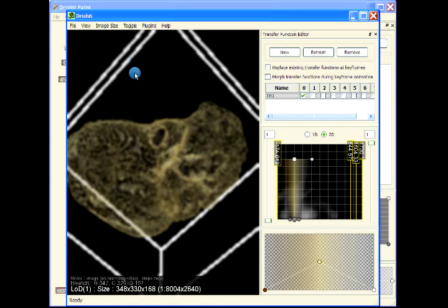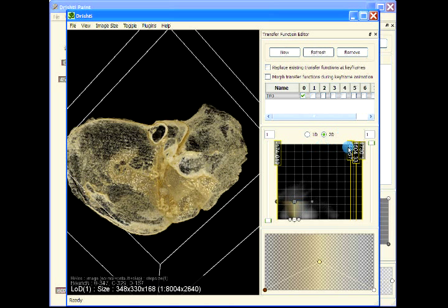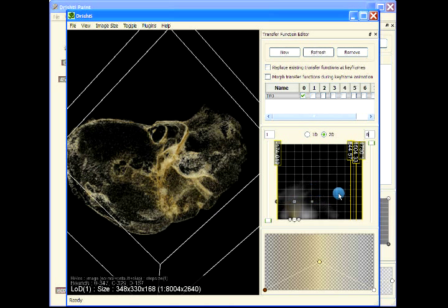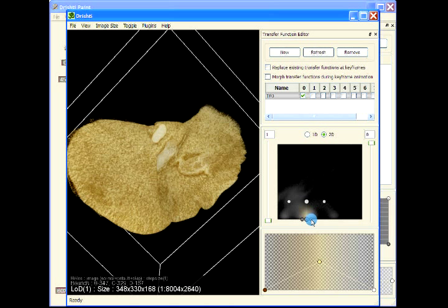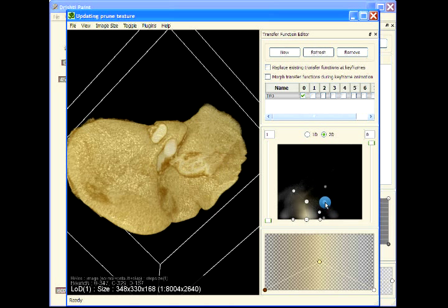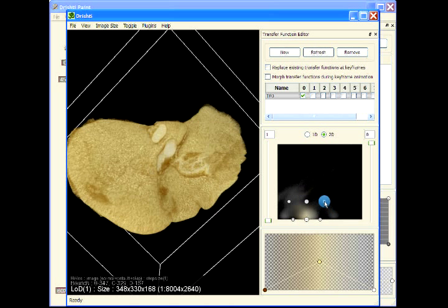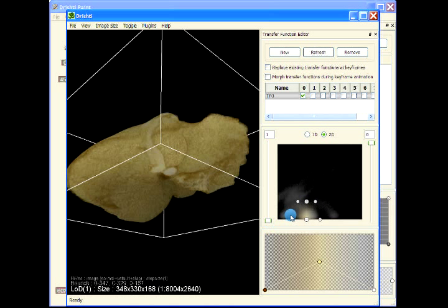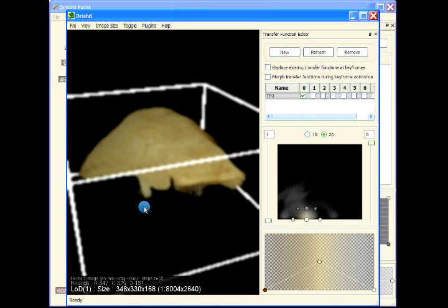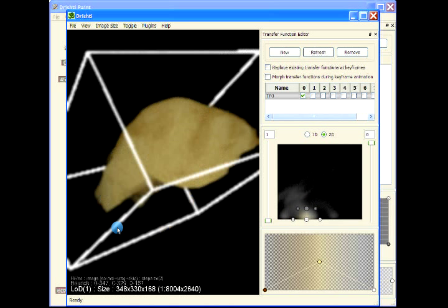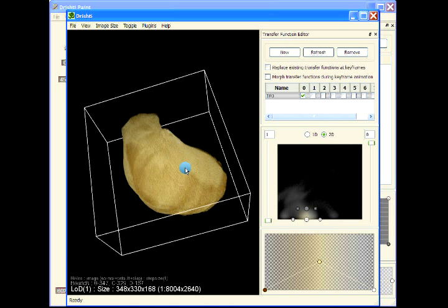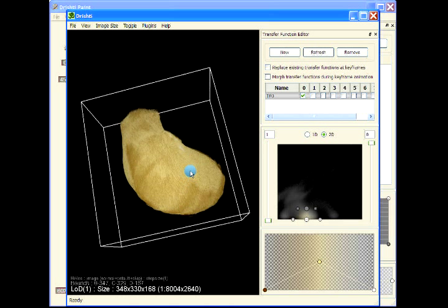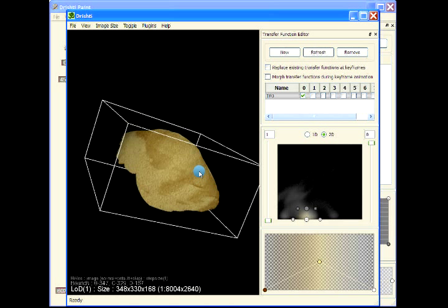This is the liver. Now this looks much better. That's the way we can quickly segment the liver. Thank you.